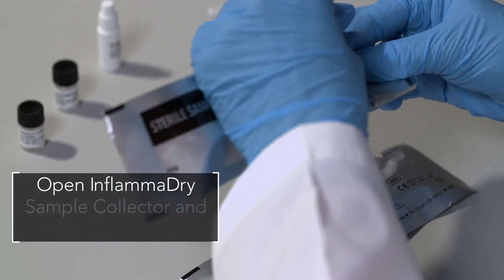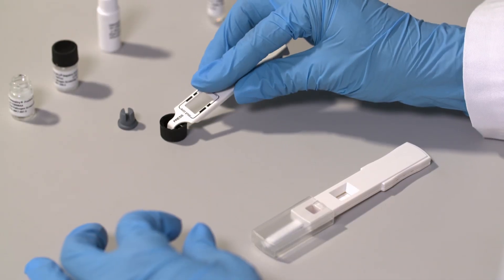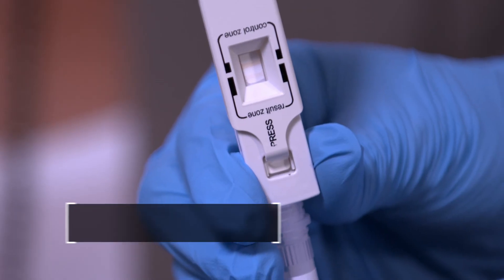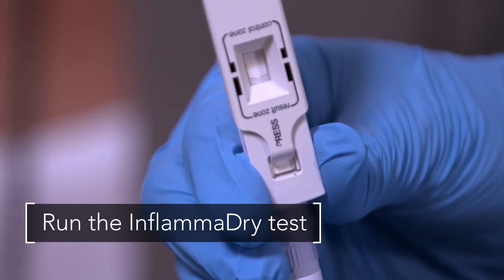Open the sample collector pouch from an unused InflammaDry test. Dip the sampling fleece into the control liquid in the black cap. Run and read the InflammaDry test results per the instructions provided in the test package insert.